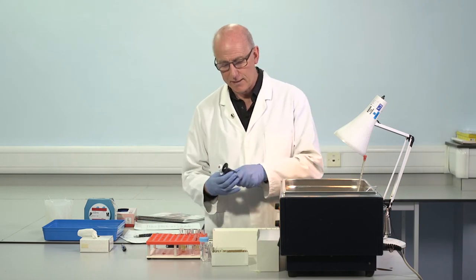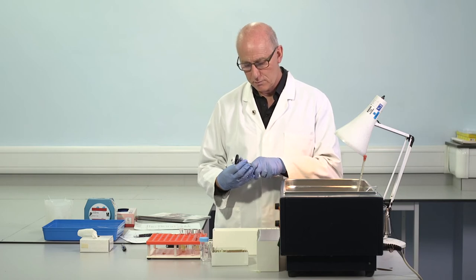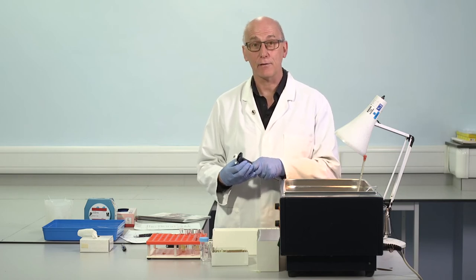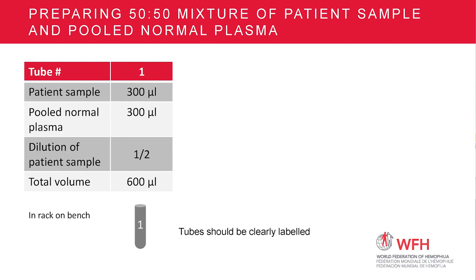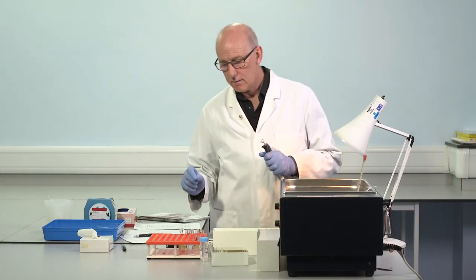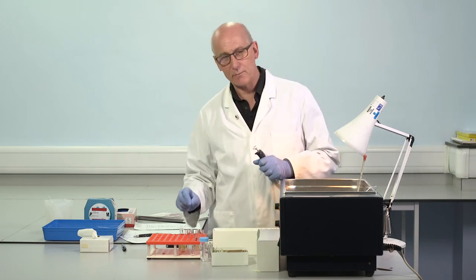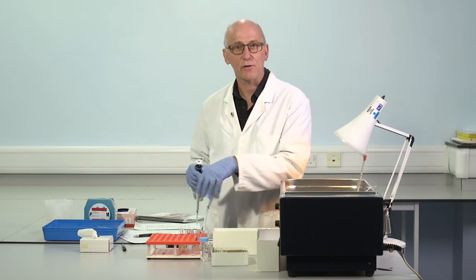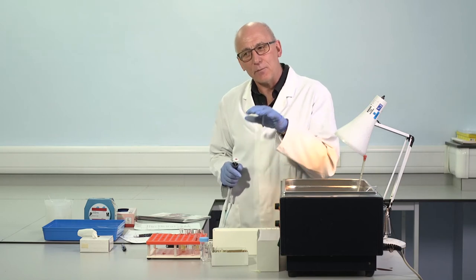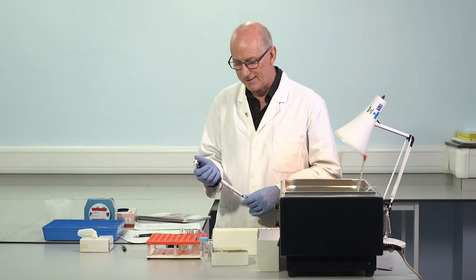So I'm going to make a mixture, 300 microliters of patient, 300 microliters of pooled normal plasma, and this will give us more than enough. We should make the mixture on patient number 1, make the test. Make the mixture on patient number 2, make the test. Make the mixture, and so on. So we shouldn't make all these mixtures up, because there is a potential for change in that mixture once it's constructed. We'll come back to that point because I think it's important.